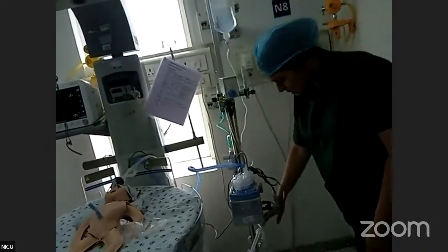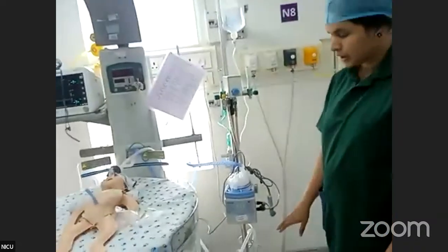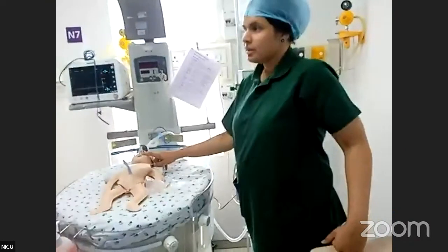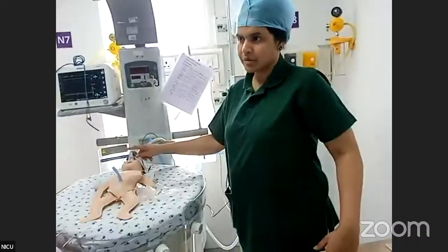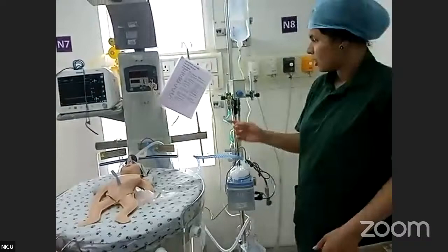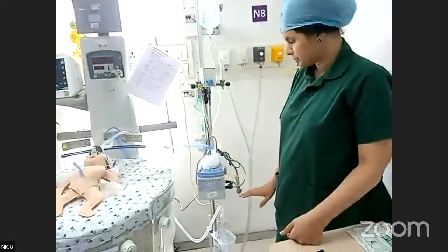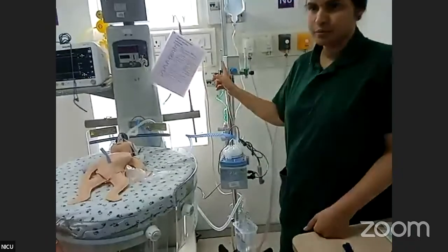The last but not the least is bubbling must be present continuously throughout the respiratory cycle during both inspiration and expiration. This only ensures optimal delivery of pressure. If bubbling is not happening, then one must look for a leak from around the interface because of an excessively loose fitting interface, or it could represent acute leaks somewhere along the circuit or inadequate gas flow. So after ensuring that there is no leak anywhere, one has to increase gas flow if there is absence of bubbling. So look for circuit leak, look for leak from the interface, or inadequate flow if there is absence of bubbling.